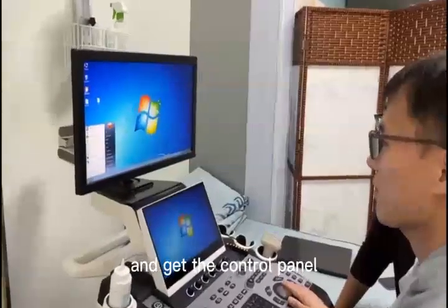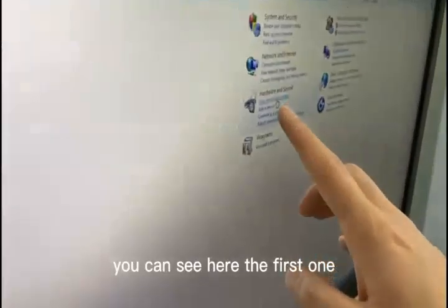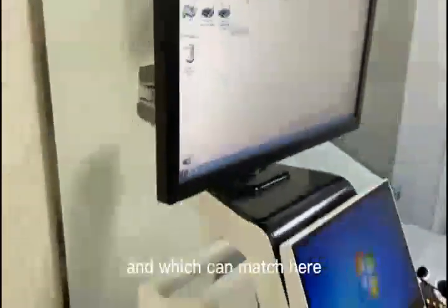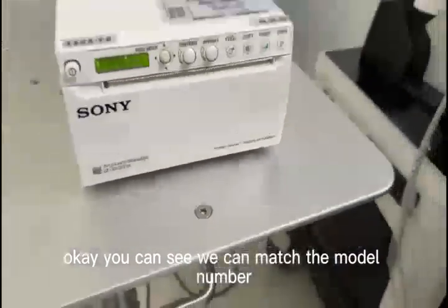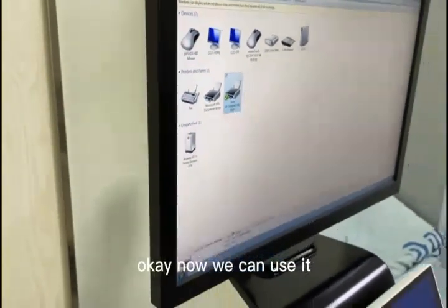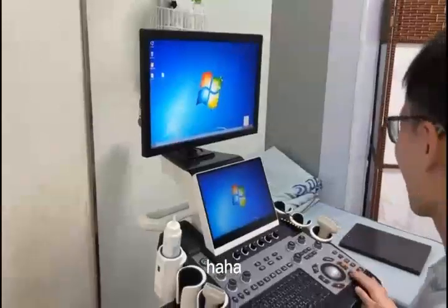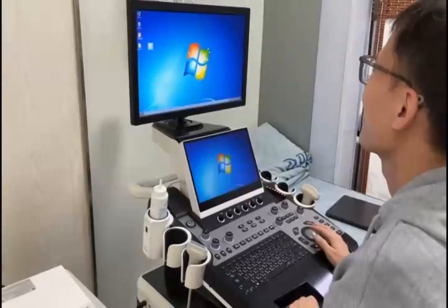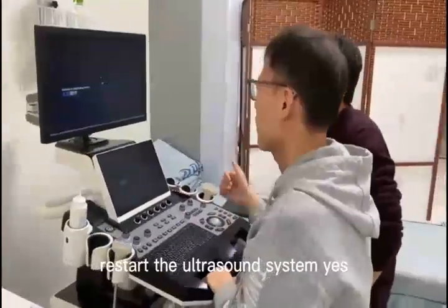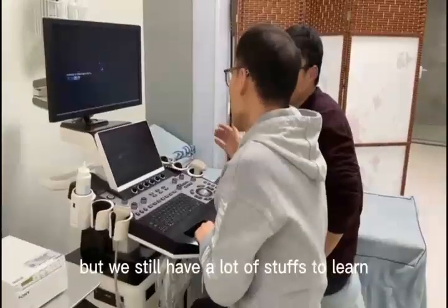Now we need to install it. Have a look. Here we need to choose Windows 7 because this system is Windows 7. Press set. If this system is Windows 8, we should choose Windows 8. Excellent — we need to match the window system. And here is setup. Next. Here we need to choose agree — I accept. Next, install. And here this one we can close it.